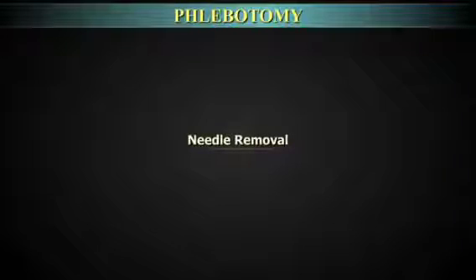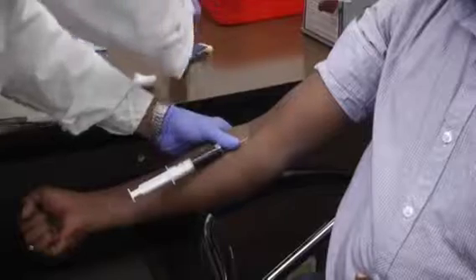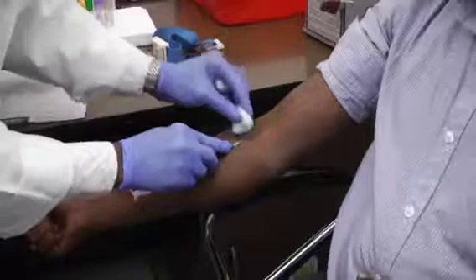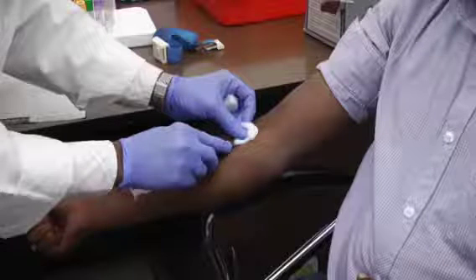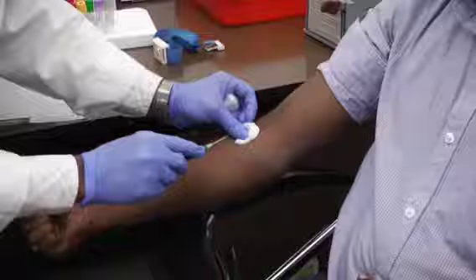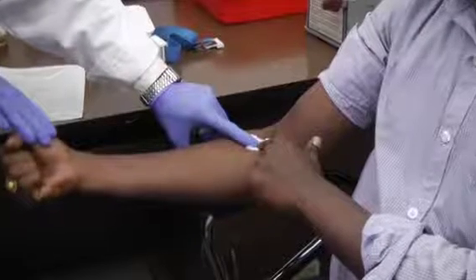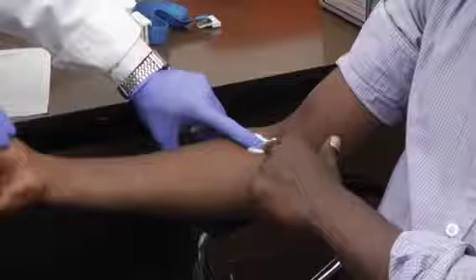Needle removal. The tourniquet must be fully released and patient's hand opened and relaxed before the needle is removed. Hold dry cotton or gauze pack over the site. Gently and quickly remove the needle from the arm, and as soon as the needle is removed, pressure must be applied to the site to avoid leakage of blood and hematoma formation.